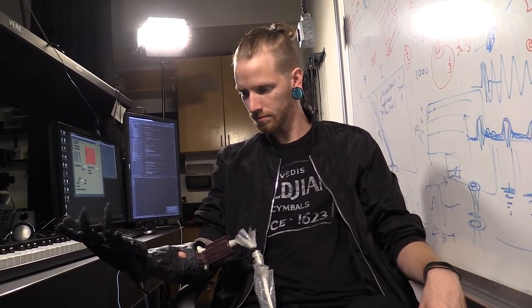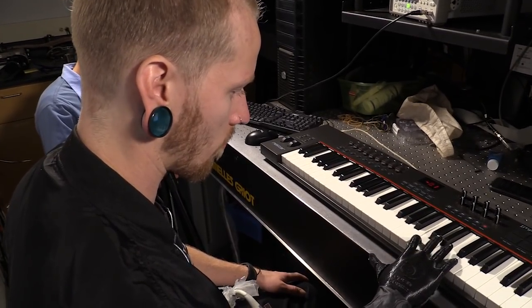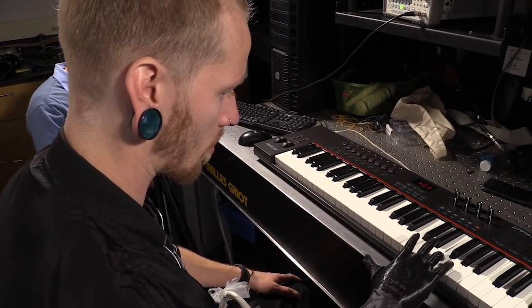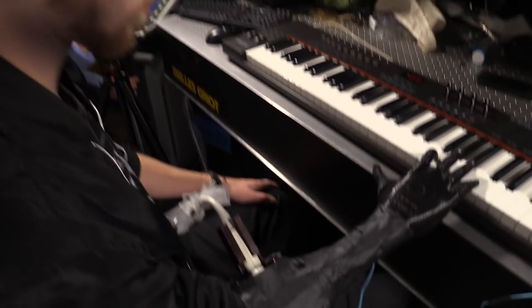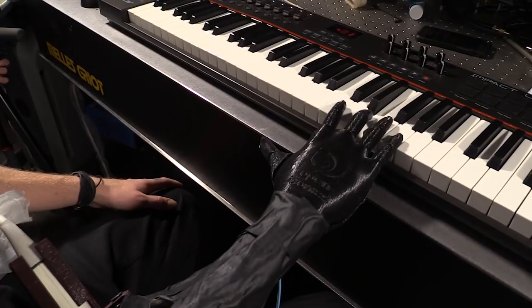It started with the drum thing, now on the piano, and eventually, hopefully, individual finger control. It was rough at first, but now I absolutely love it. I love coming in here and testing out stuff and trying the new, latest and greatest things.